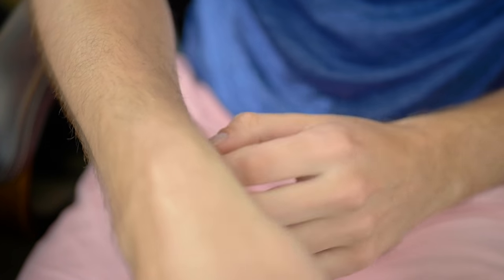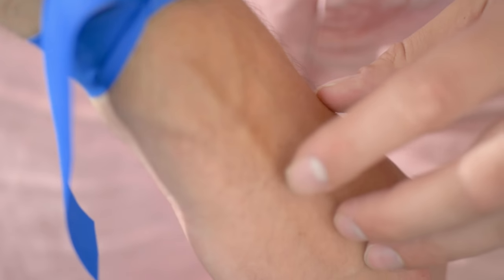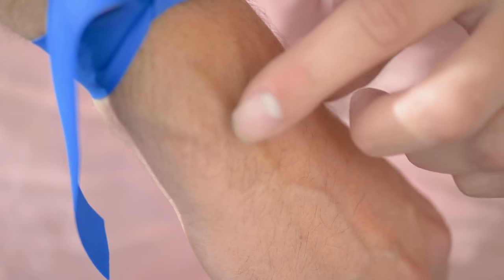I go by sight first and then, depending on what I see, I'll start feeling around to see if they might be suitable veins. There's also always that wrist radial vein right there to consider.